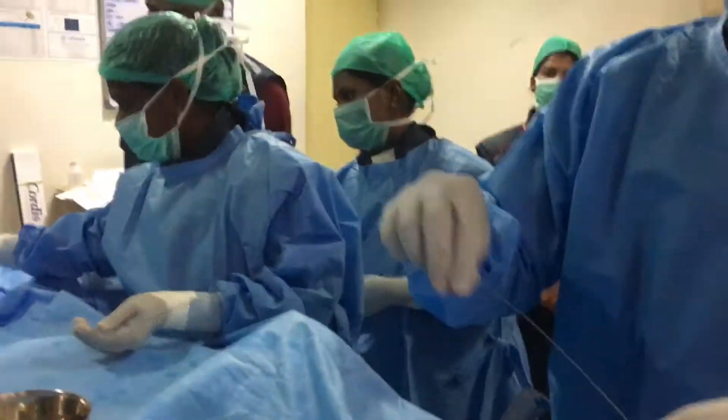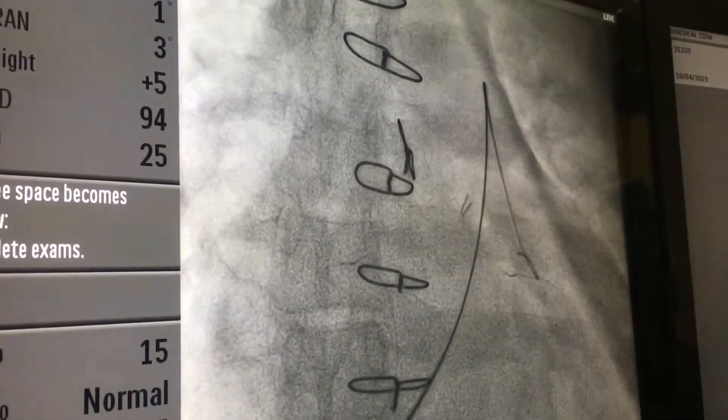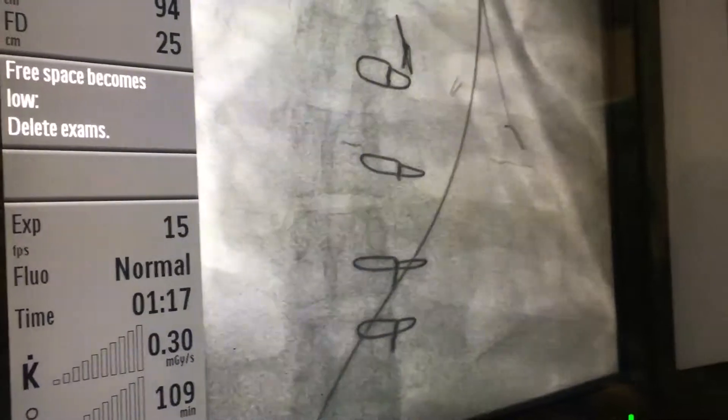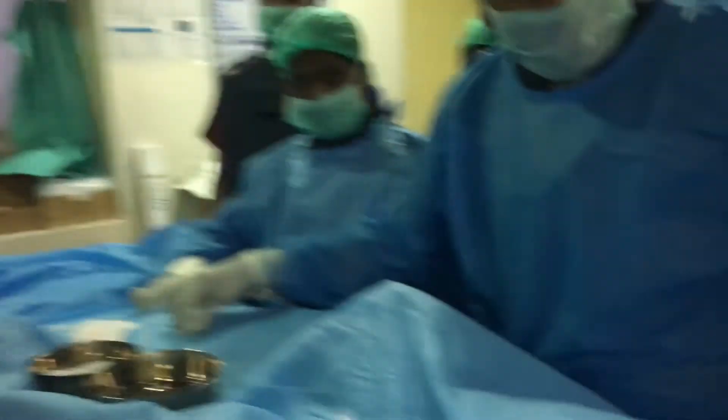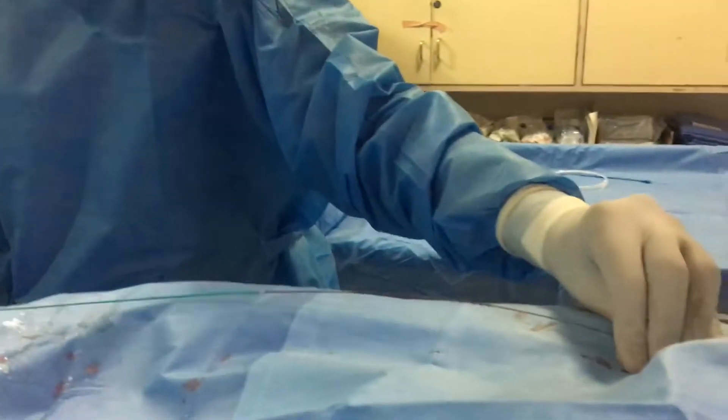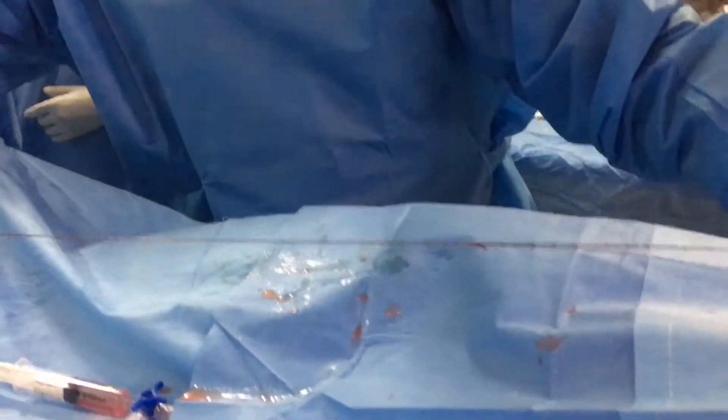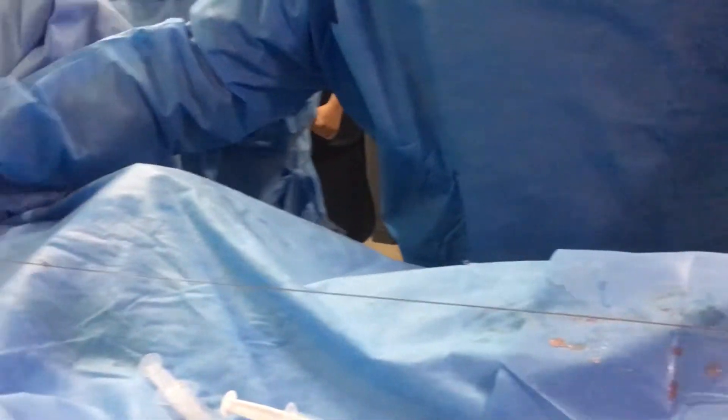So you can show the fluro. So I have reached PA. So I'm just removing this multipurpose catheter. And then we just do the usual exchange, what we do. So I'm just wiping.